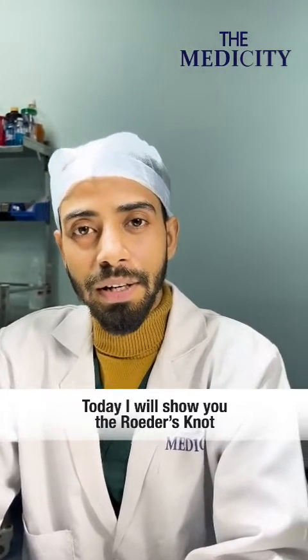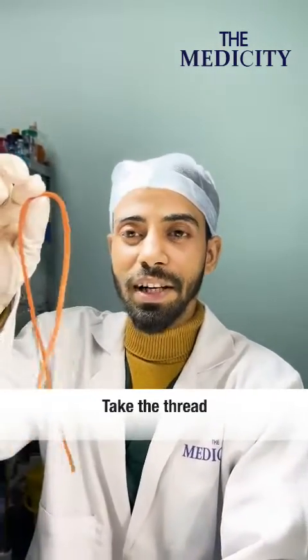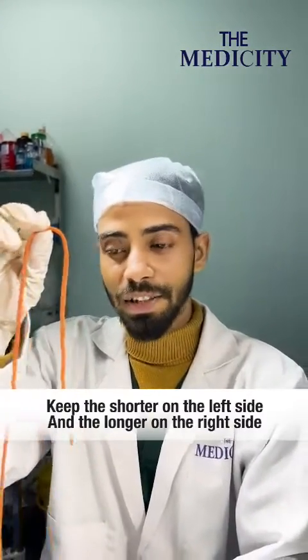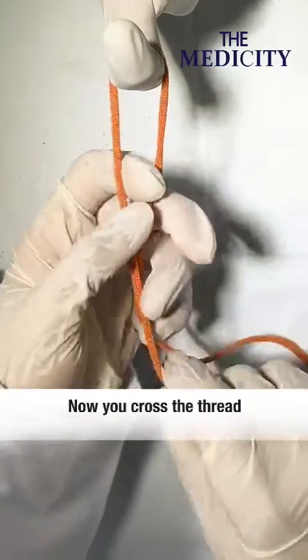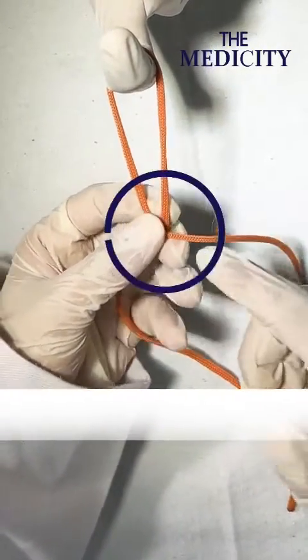Today I will show you the Roeder's knot and the configuration is 1-3-1. Take the thread, keep the shorter on the left side and take the longer one on the right side. Ask the assistant to keep his finger. Now you can cross the thread shorter over the longer one like that.